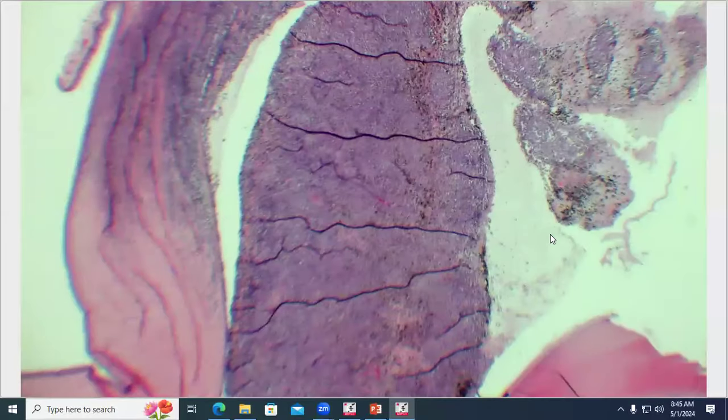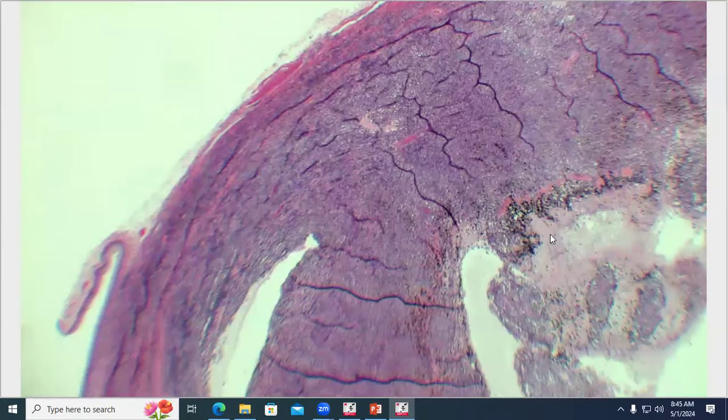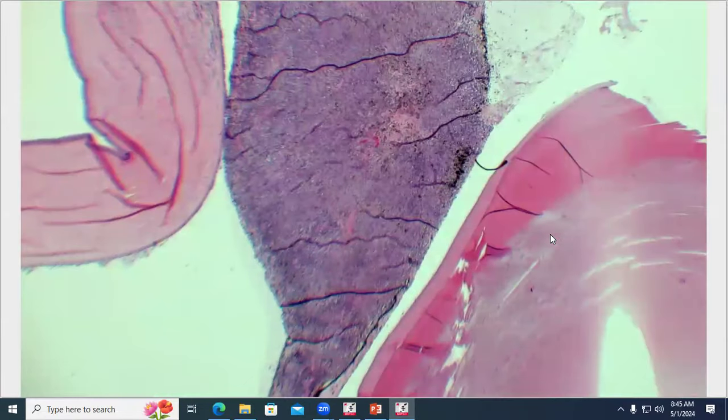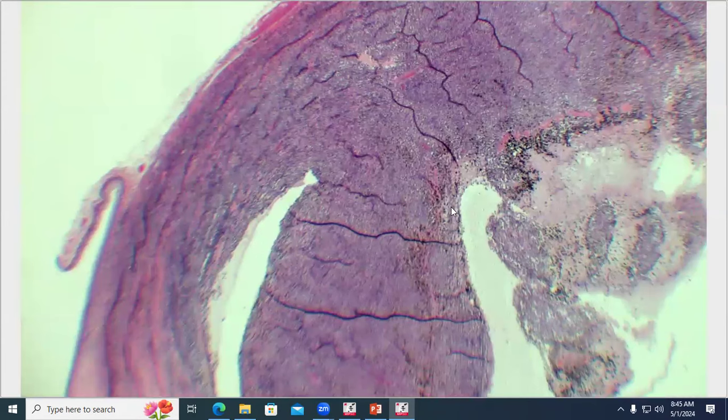The main thing is the infiltrate throughout the uvea as we described. So marked expansion of the iris itself or the ciliary body. There's loss of the iris pigmented epithelium and the ciliary body. You can see the plica is sort of melting away, as you will, right? And there's a lot of free melanin pigment. There's dispersion of pigment everywhere.